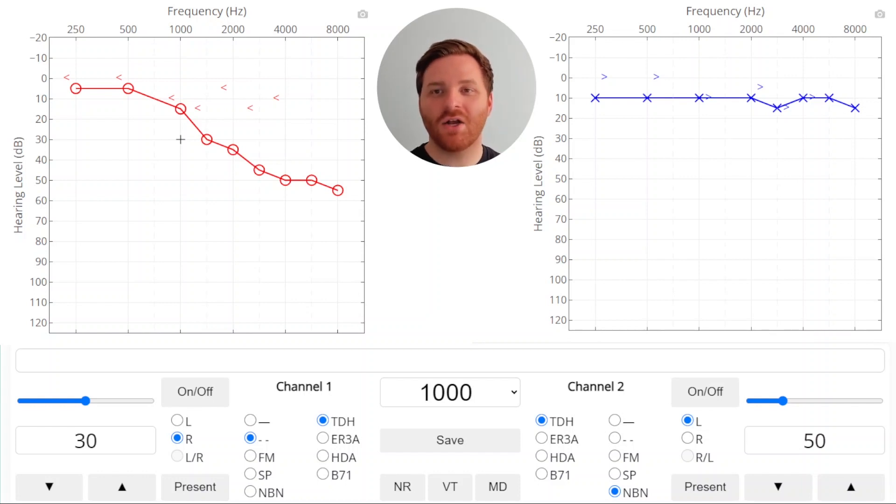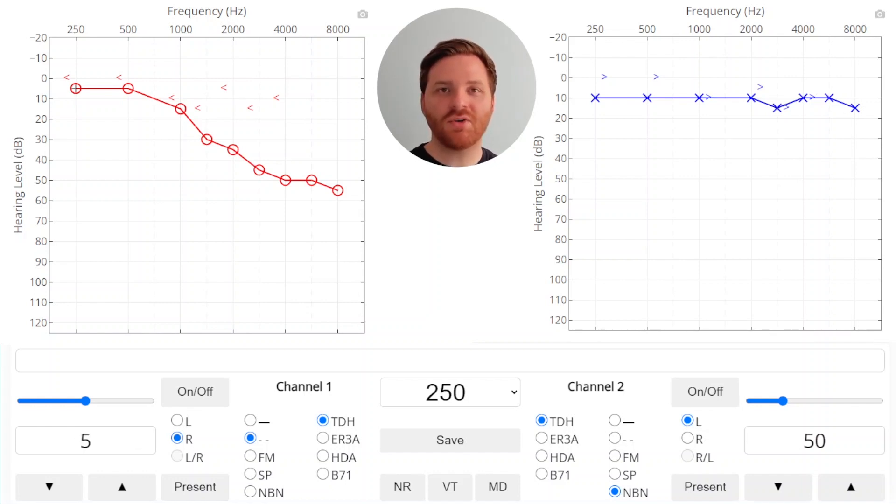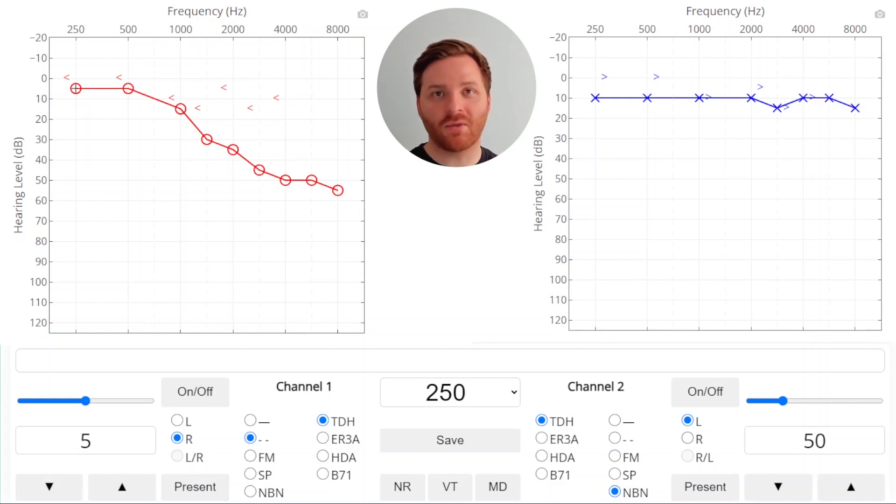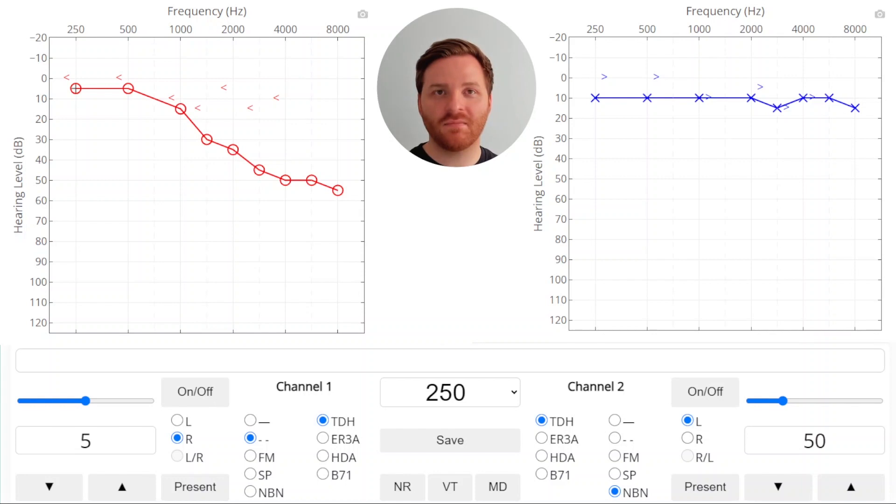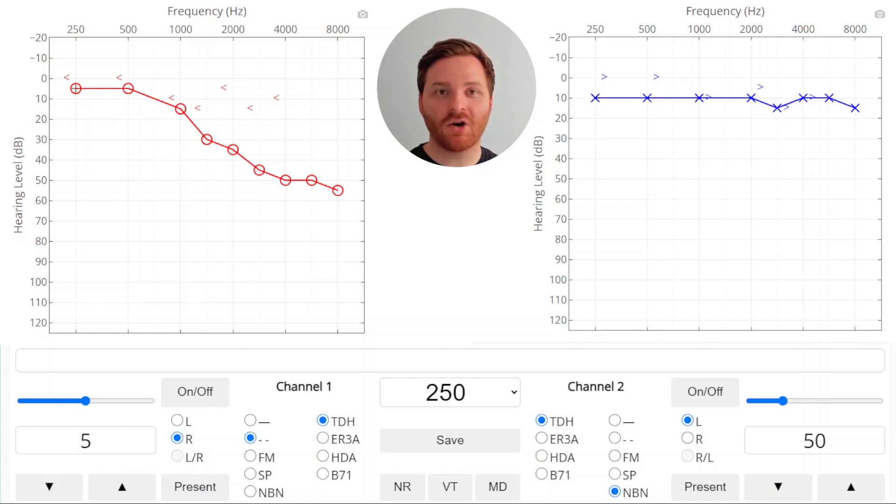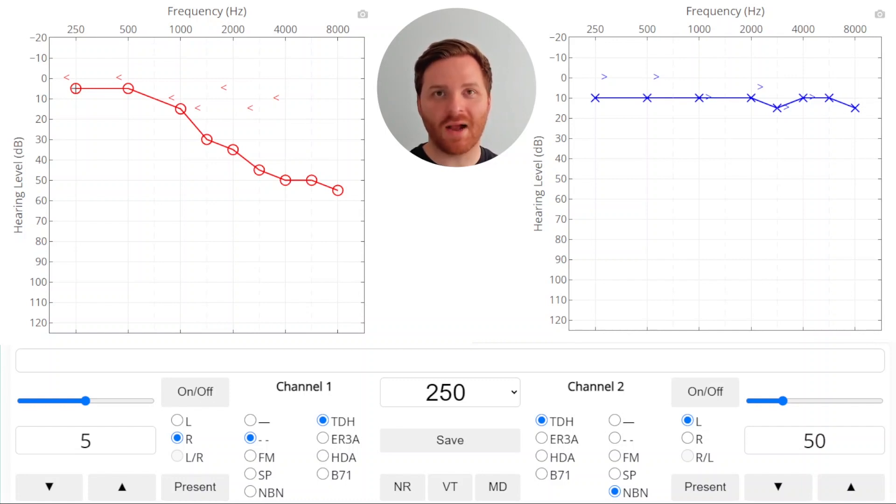Let's go for it now. So we'll start at 250 Hz and we're going to be comparing the worst hearing ear, the right ear, to the better hearing ear, the left ear. If there is a chance that the sound is loud enough in the right ear to be heard by the left ear, then we're going to be concerned that our threshold may not actually be correct and we would need to mask.